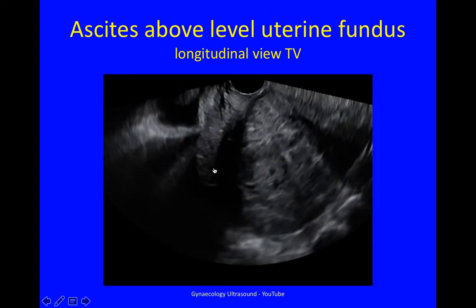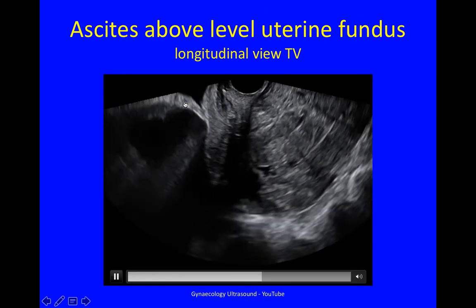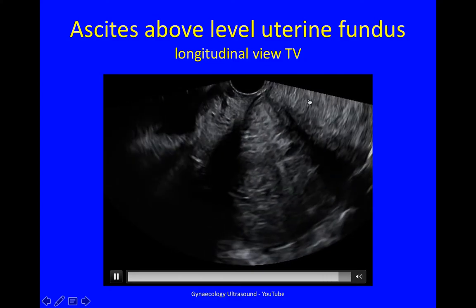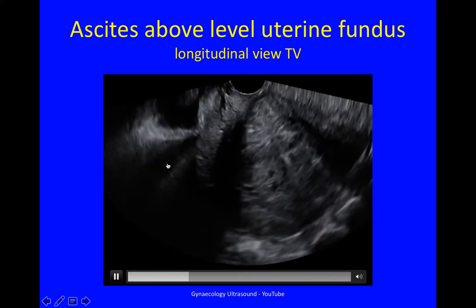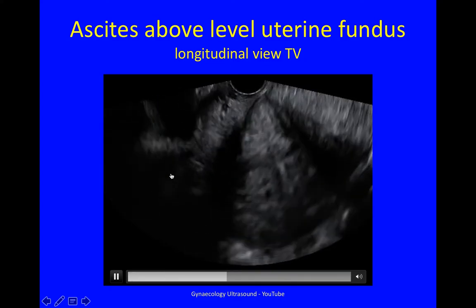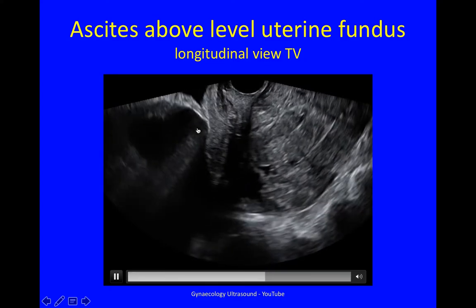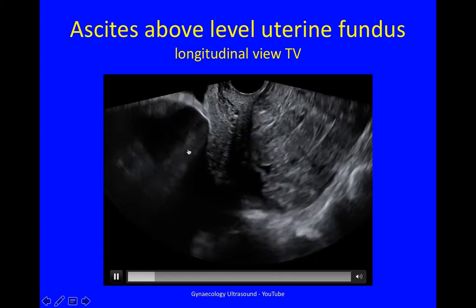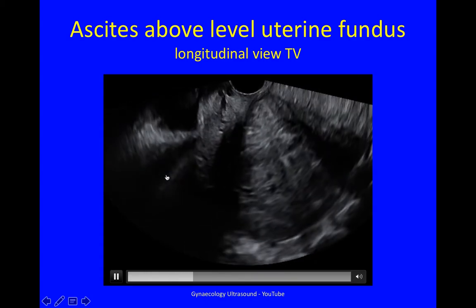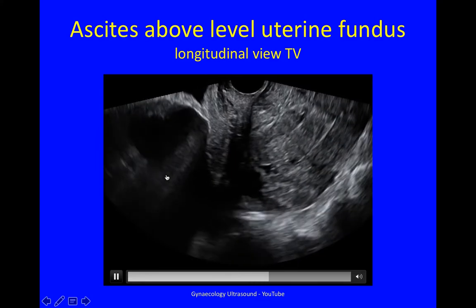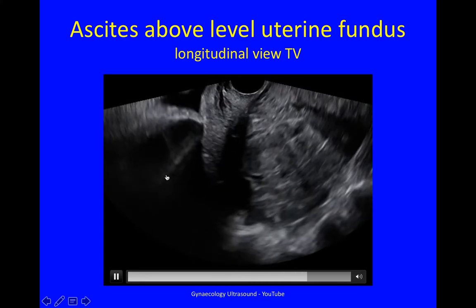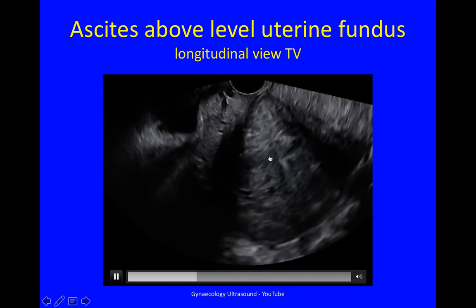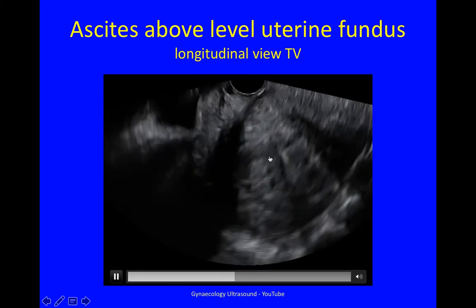This is a video of the same case. Bladder, axial uterus, a mass in the pouch of Douglas, and ascites — fluid beyond the fundus of the uterus. You can see there's some artefact there, and you can see how the uterus moves within the fluid against the mass.